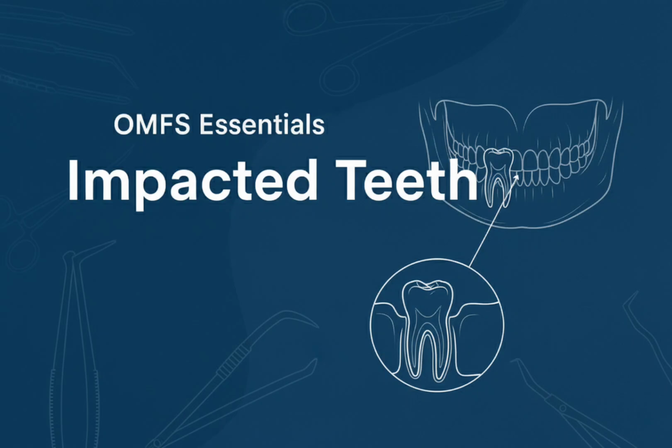Bone removal, osteotomy. The goal is judicious bone preservation. The tooth is sacrificed, but the bone must be preserved. Bone cutting methods. Rotary instruments, preferred. Use sharp stainless steel or carbide burrs at an ideal speed of 18,000 to 20,000 RPM with adequate torque.